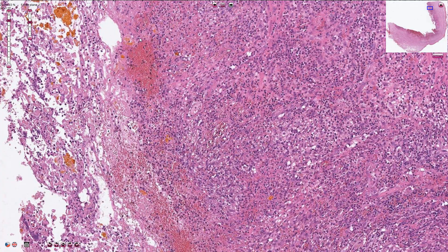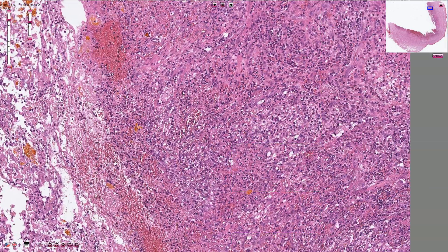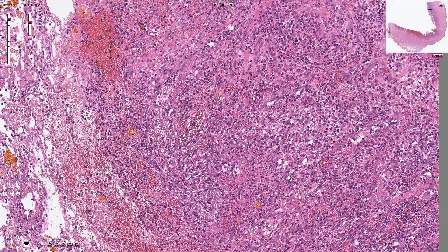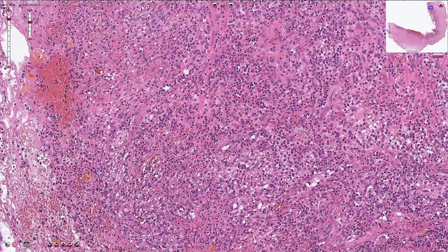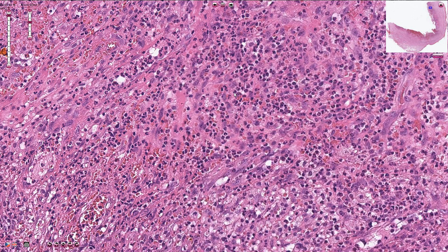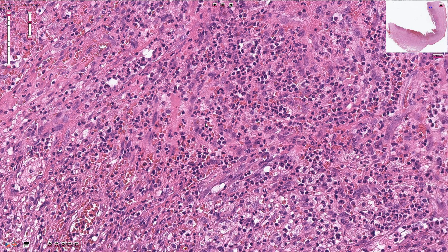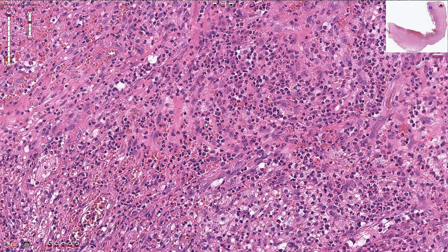Here we see some hyperemia and small foci of bleeding, and here we see all of these cells — those are actually neutrophils. Note the multi-lobated nuclei of these cells. This is a typical morphological sign of acute inflammation.